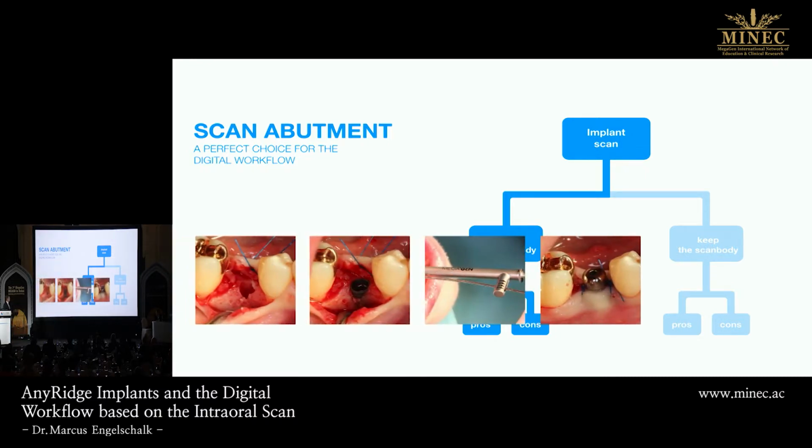So this means in pictures, you drill a hole, you bring in the implant with a high insertion torque. I love this high insertion torque, believe me. And then you bring in this healing cap, healing abutment, whatever you call it, and you suture it and let it heal for some months. And afterward, you will change it.